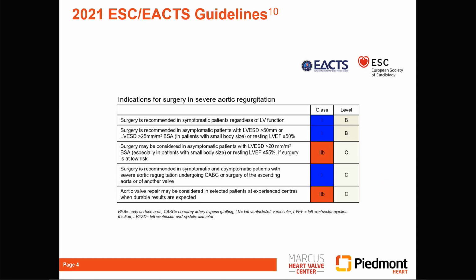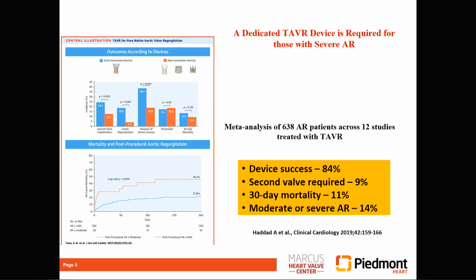And if you look at the European guidelines, again, there's nothing about transcatheter valve therapies in any guidelines for AR and TAVR. Now, having said this, the JenaValve is the valve approved in Europe, and in the United States by the end of 2025, it will also be approved, as far as I understand it. Historically, and I've done a lot of these cases, we've used the Sapien and the CoreValve and the Navitor to treat patients that were not made for aortic regurgitation.